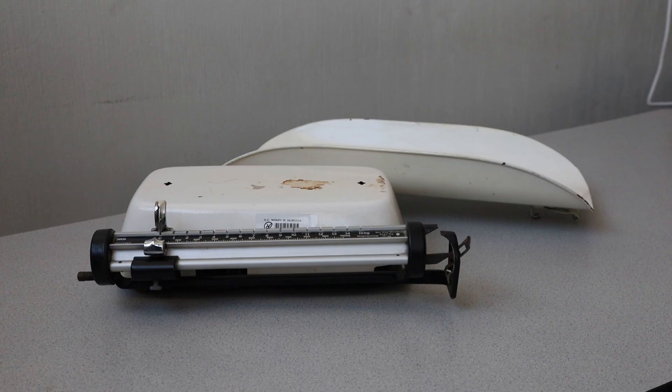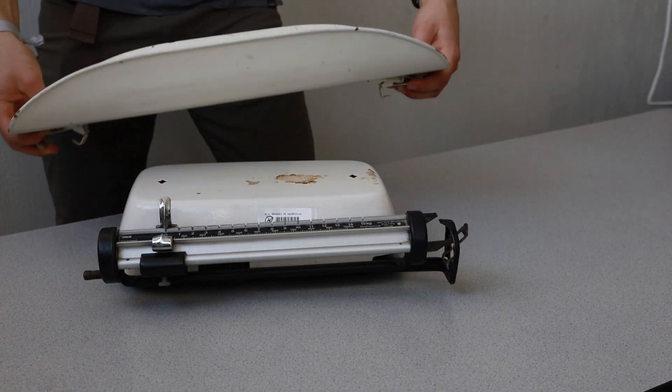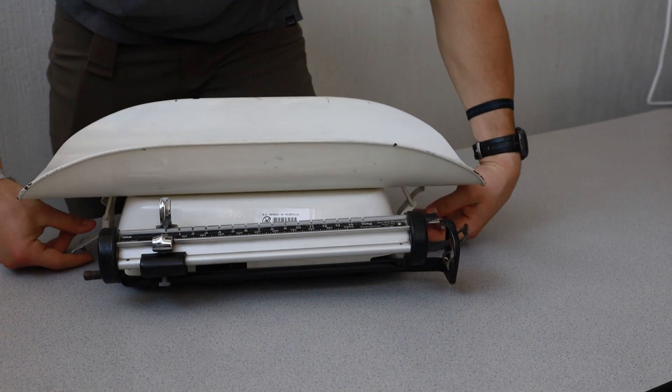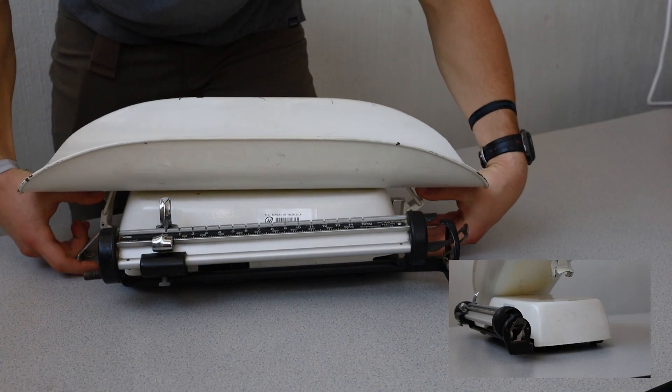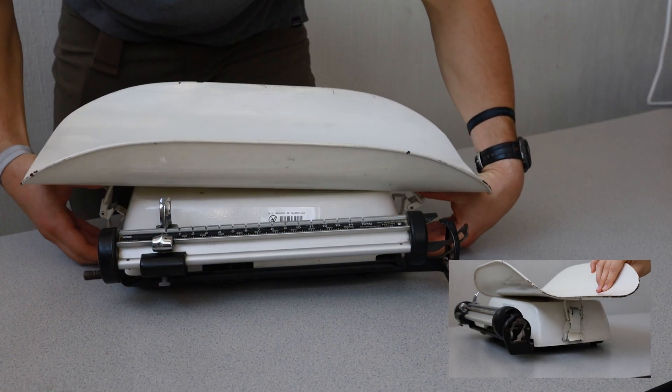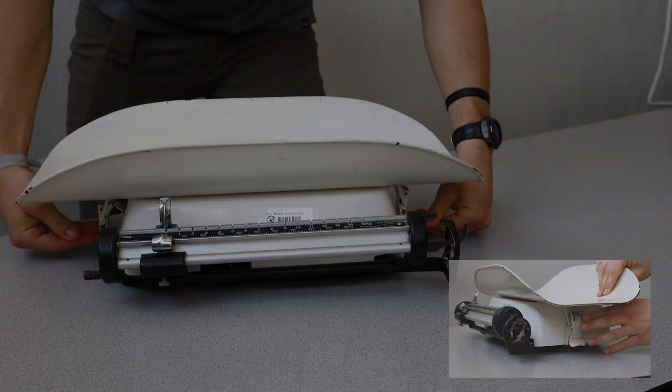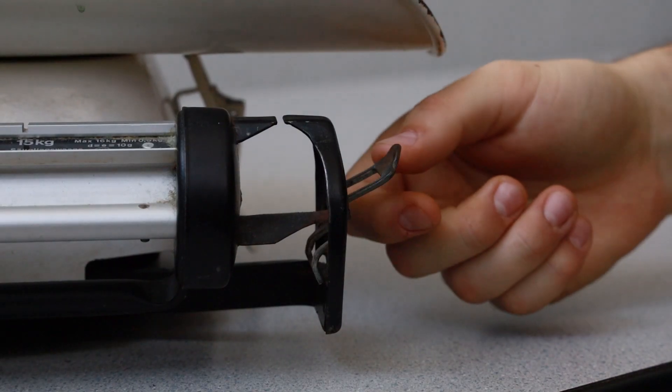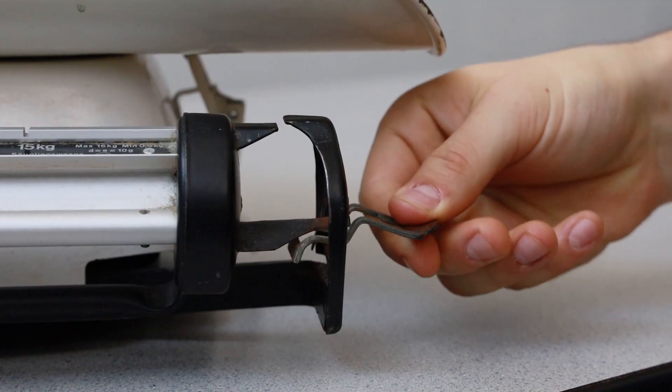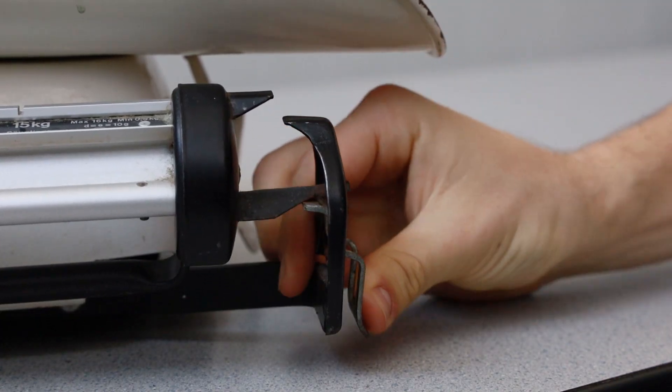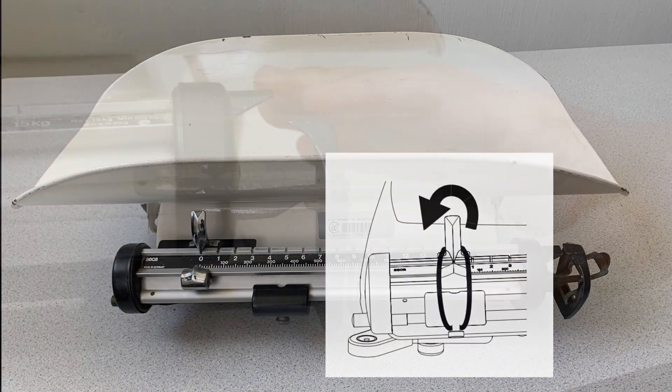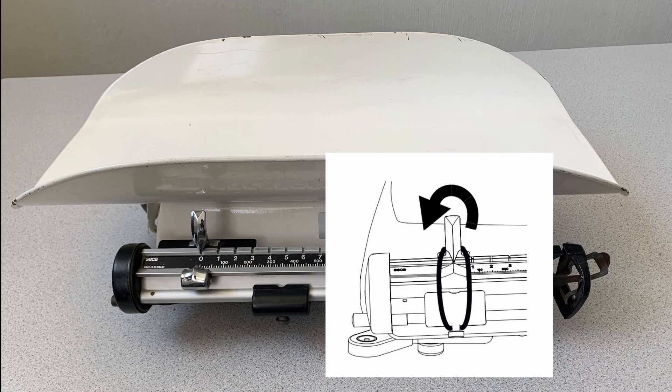To transport the scale as a single unit, ensure that the tray is securely attached to the bottom half of the scale system by locking the side latches in place. In addition, activate the transport lock to ensure the beam is not damaged during transport. Consider using a rubber band to lock the sliding weights to the tear weight during transportation to prevent damage or sliding of the weights.